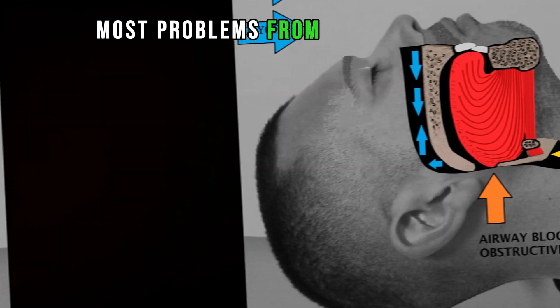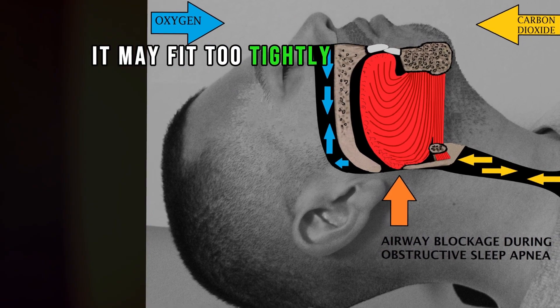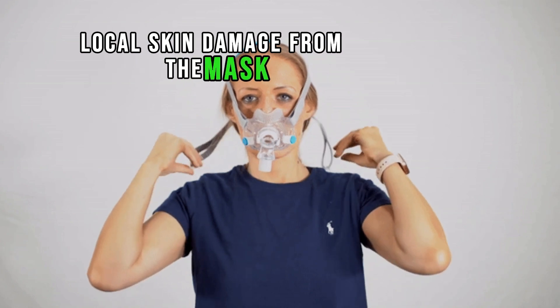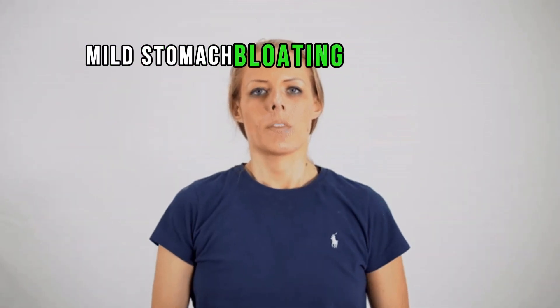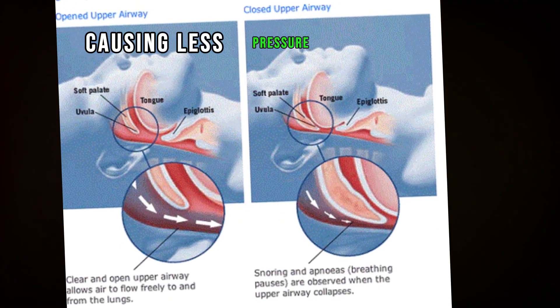Most problems from BiPAP involve the face mask — it may fit too tightly. Some other risks include local skin damage from the mask, mild stomach bloating, dry mouth, and leaking from the mask causing less pressure to be delivered.